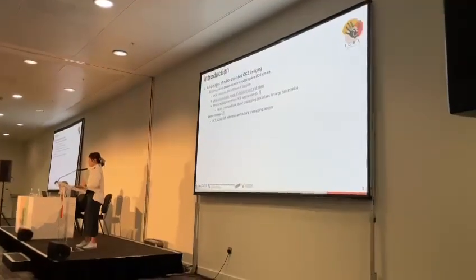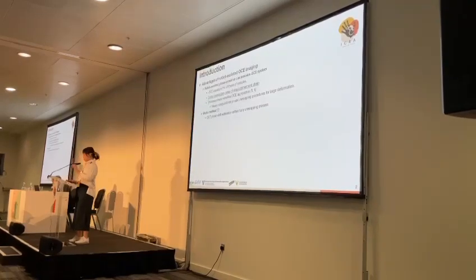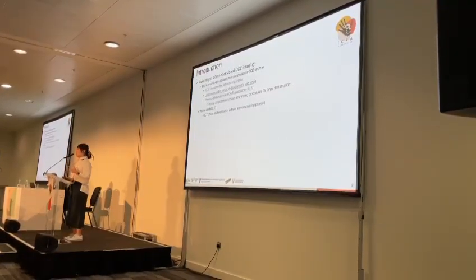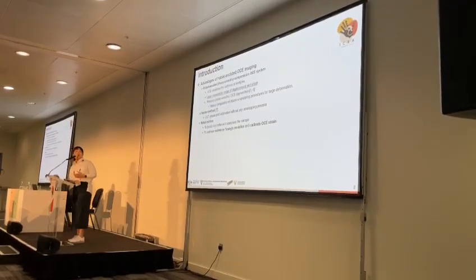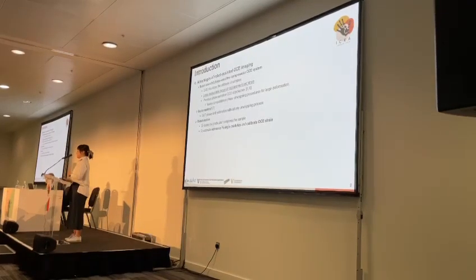Therefore, we use a vector method to estimate the OCT phase shift between frames to produce the phase-assisted strain map. Also, we use the robot motion to locate the probe and compress the sample.